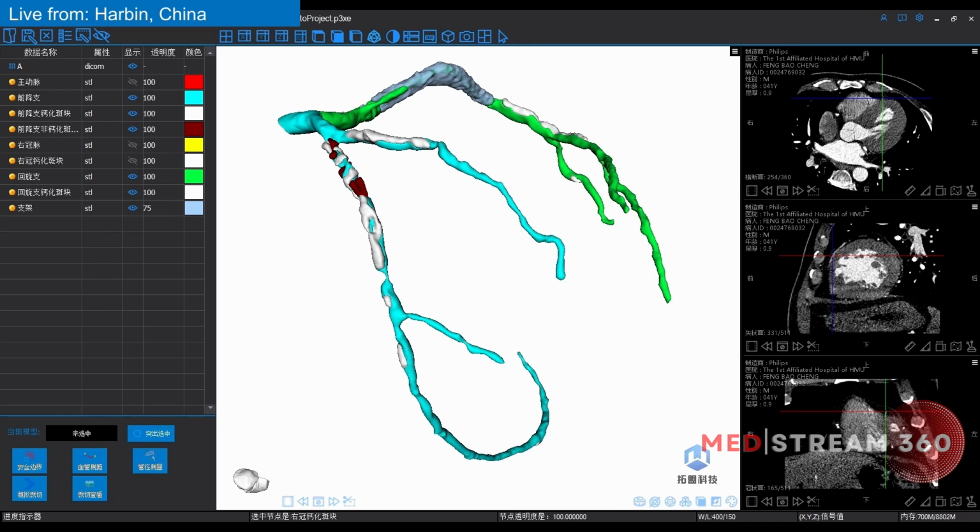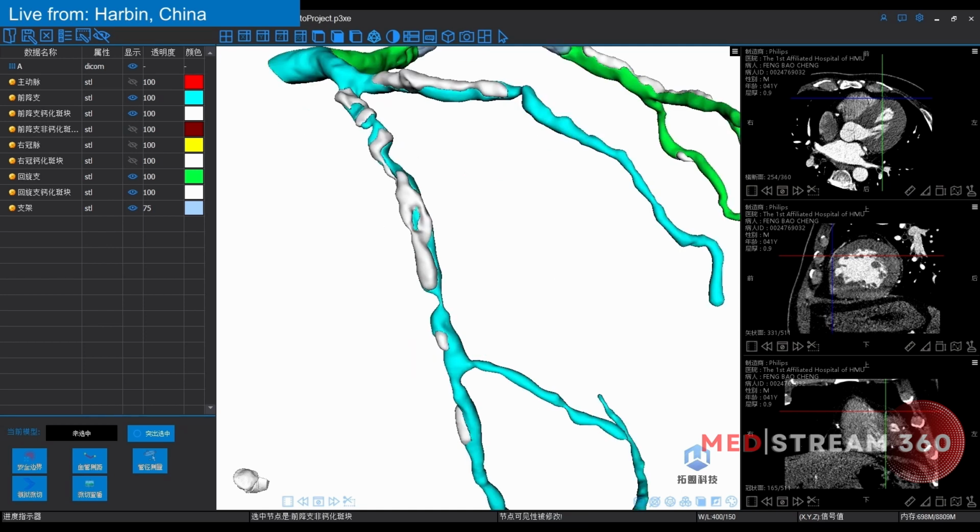But we can see a severe calcified lesion in the proximal LAD, and only a little bit of soft plaque. Most is calcified lesion. This is why the first time, a very experienced CTO operator couldn't successfully recanalize the CTO lesion. We can see very clearly the calcified lesion distribution, and there should be a small stump ostium of the diagonal branch. And certainly, I think the cap is very stiff.